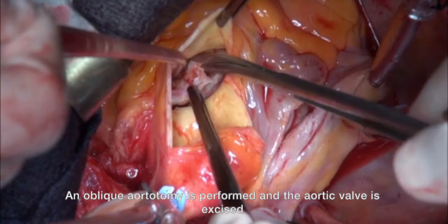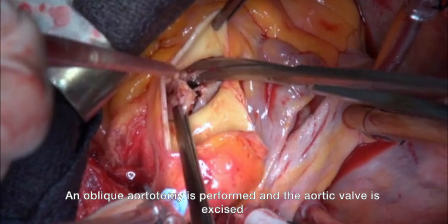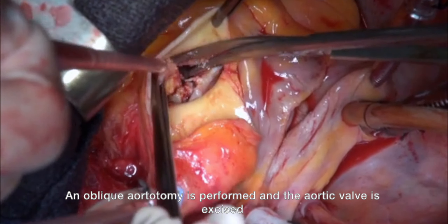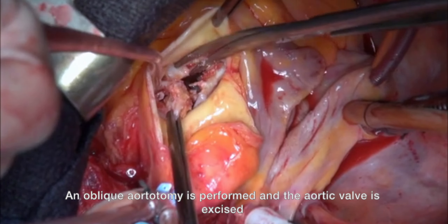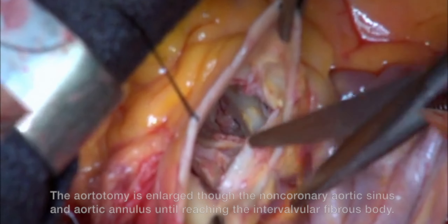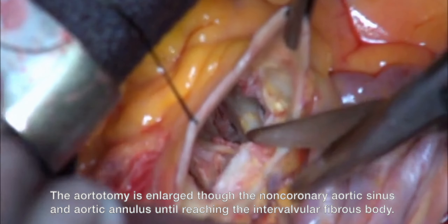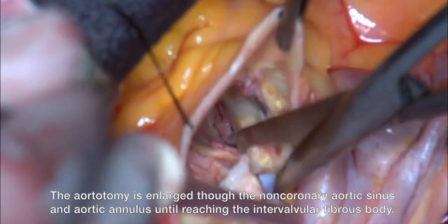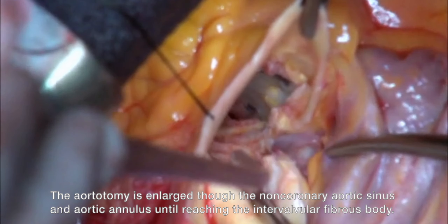According to the technique described by David and Collis, an oblique aortotomy is performed and the aortic valve is excised. The aortotomy is enlarged through the non-coronary aortic sinus and aortic annulus until reaching the intervalvular fibrous body.